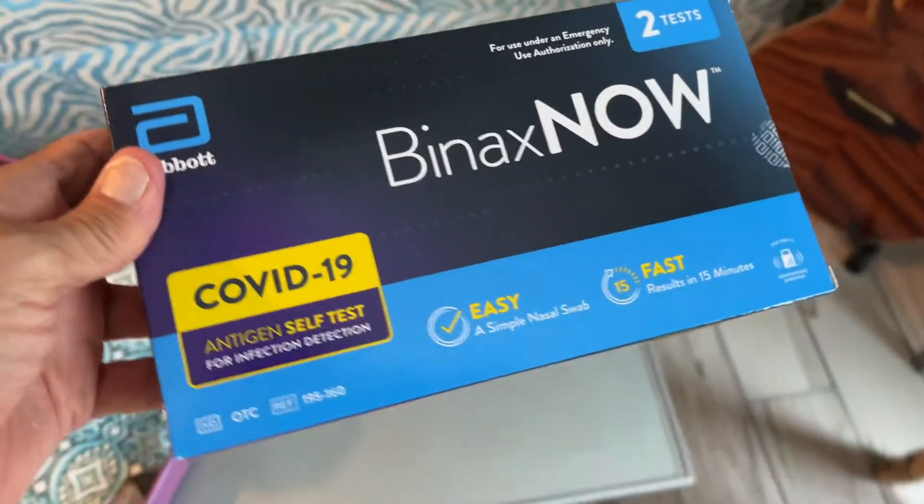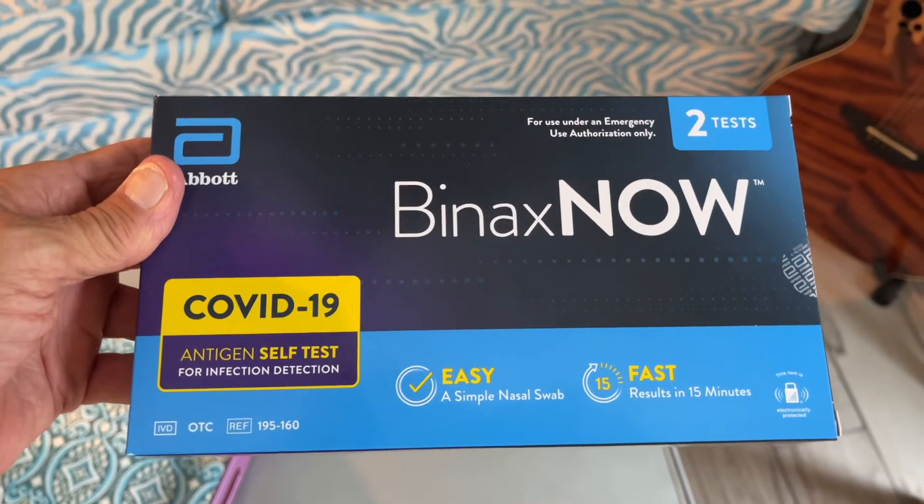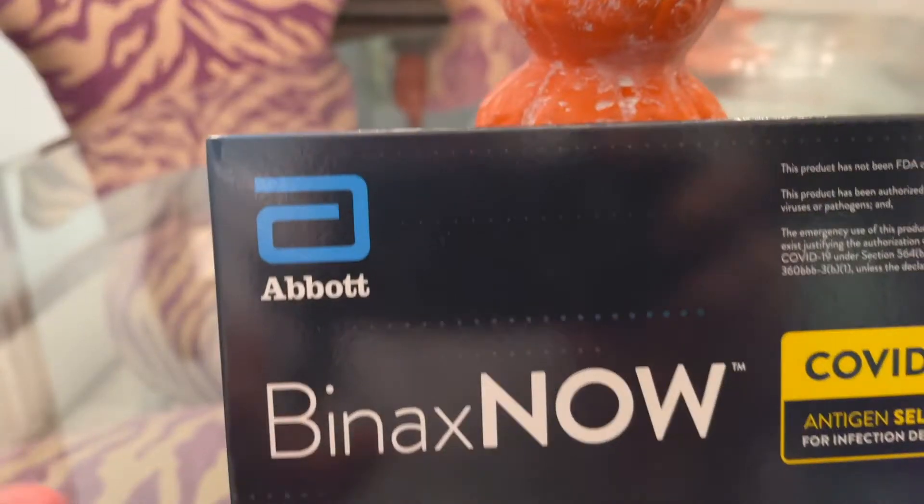You can buy these at CVS. They're about 26 bucks. It's an antigen self-test for infectious detection by Abbott.